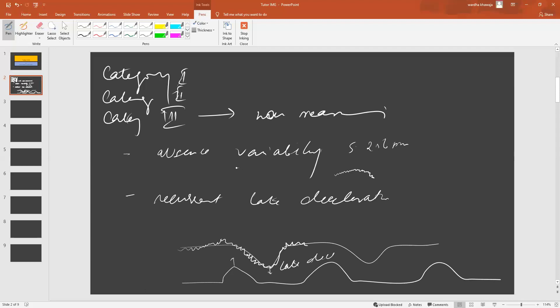Why am I focusing so much on variability? Because variability is one of the most important factors in determining course of action. So, this is late deceleration.